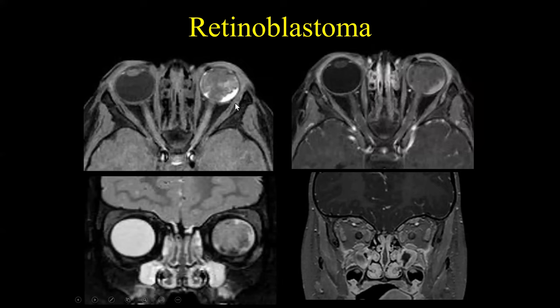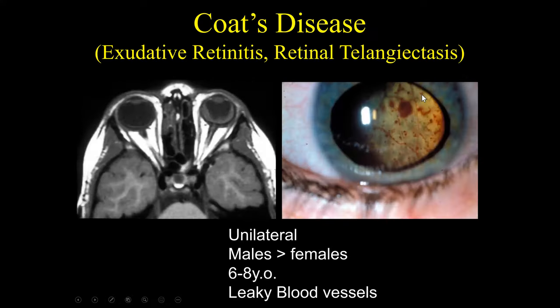When looking at retinoblastomas, we look for calcification on CT, but you also want to perform MR. On MR, especially in retinoblastoma, you look for whether it extends posteriorly to involve the posterior aspect of the globe and whether there is abnormal extension along the optic nerve. In this case, we see the normal appearance of the optic nerve on the right, and a little bit of enhancement on the left, indicative of the retinoblastoma extending along the posterior aspect of the globe and involving the most anterior aspect of the optic nerve.